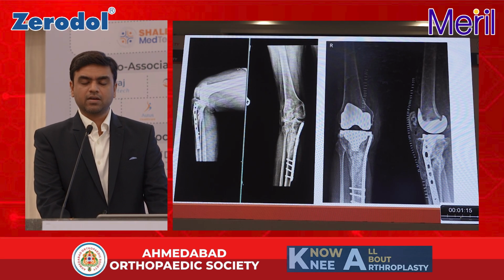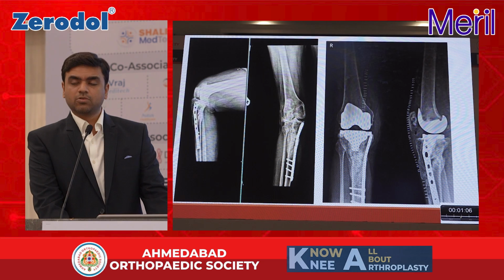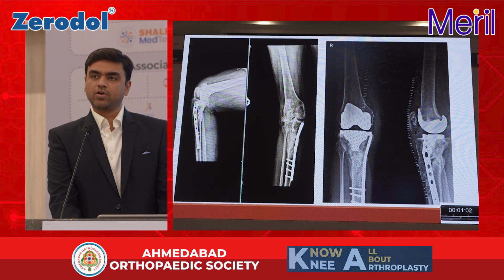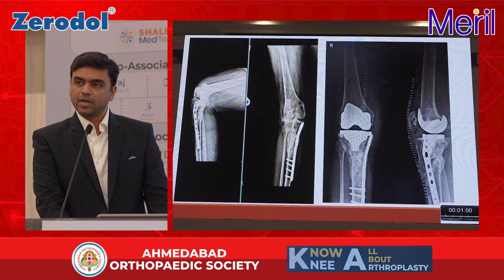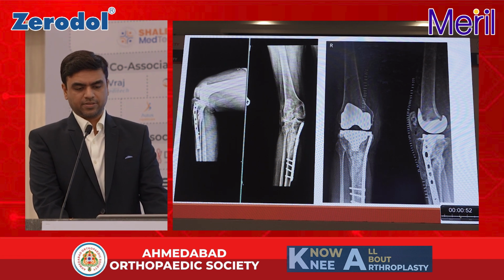So this was again a very stiff, rigid, uncorrectable valgus knee. The patient had a severe FFD as well in this case. To get good alignment in such cases is very difficult intraoperatively. Even with the robot, we had a little bit of struggle in exposure and all. So eventually we got a great outcome in these cases.